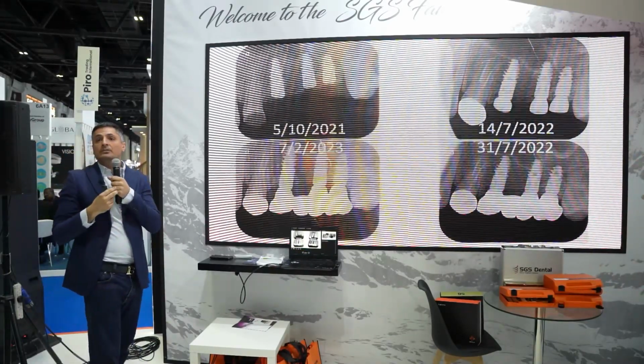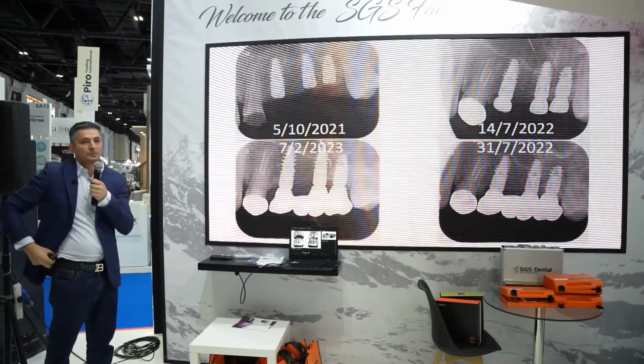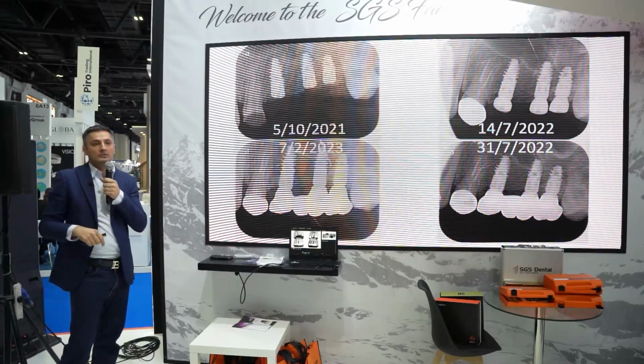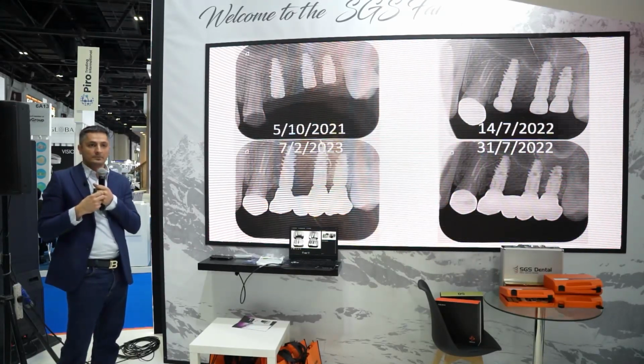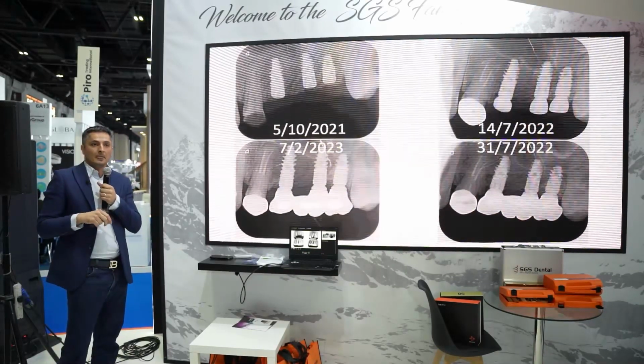So, xenograft, all the guided bone regeneration I do is with xenograft. You can mix it with allograft, no problem. But allograft alone is a big question mark. There will be resorption. You will not see the bone after a few months. The allograft will resorb. If you mix it, it's okay. If you put xenograft, it's okay. But alone, never.